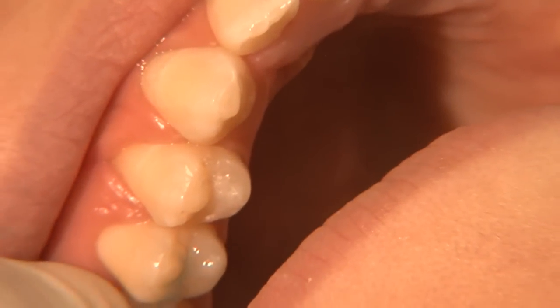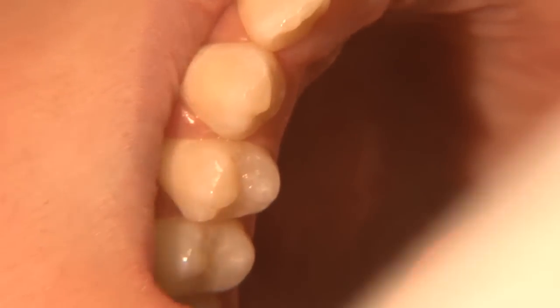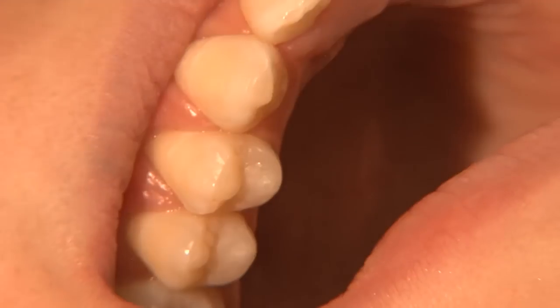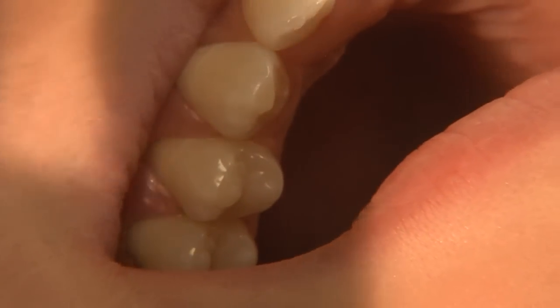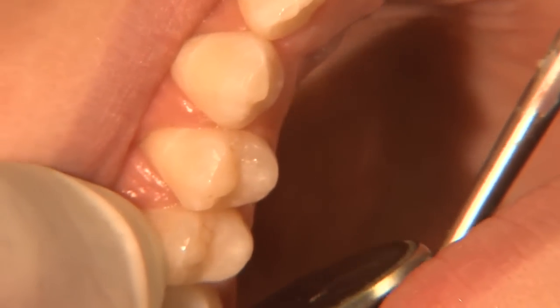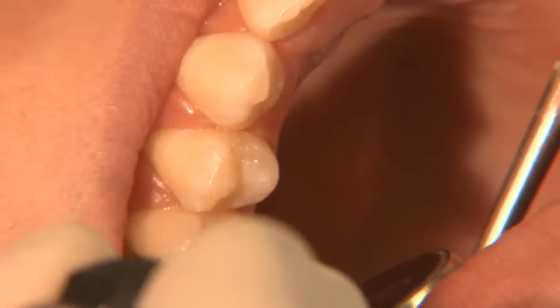For hygiene purposes, we're not going to spray it with a spray of water as recommended — we're just going to use a moist gauze to remove the etch. Then, using a cotton roll and a little blast of air to dry it further, the condition of the tooth shall be chalky white. Now I'll ooze a little bit out of the tip and then apply the sealant to the tooth.